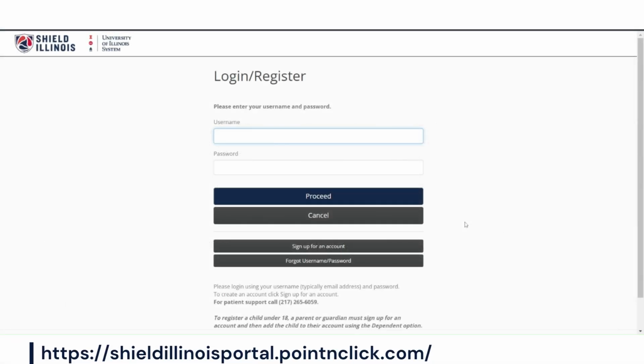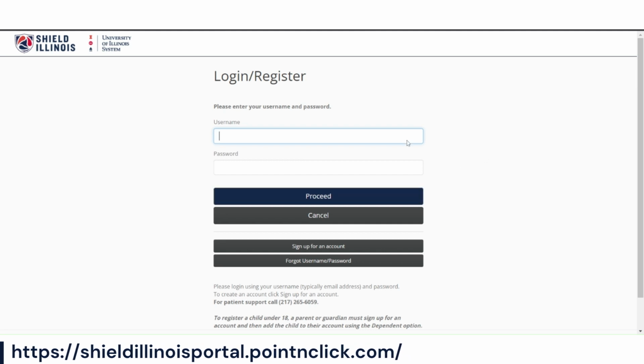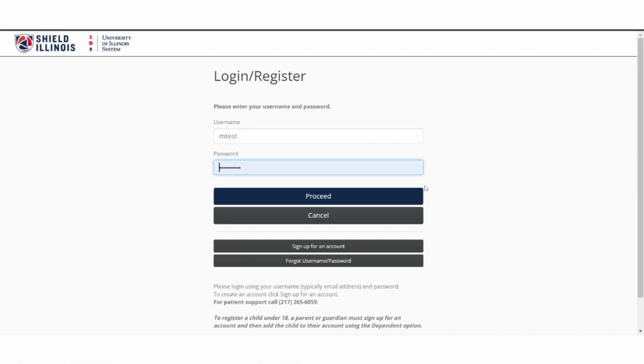Follow the instructions to provide your saliva sample. Once you have deposited your saliva sample in the vial and tightly closed the cap, log into the Point and Click Patient Portal. This is the same way you log in to view your results from previous Shield tests. Enter your username and password and click the Proceed button.